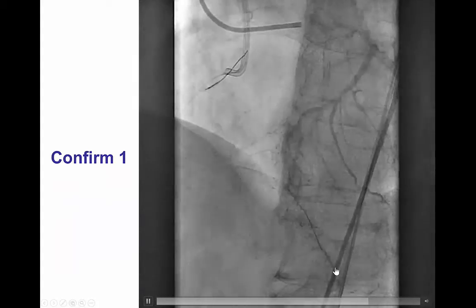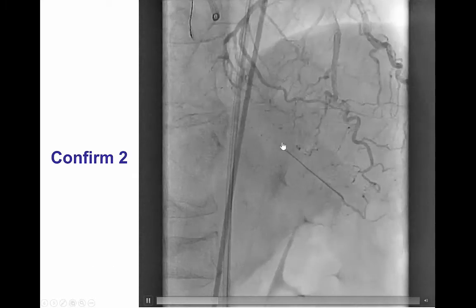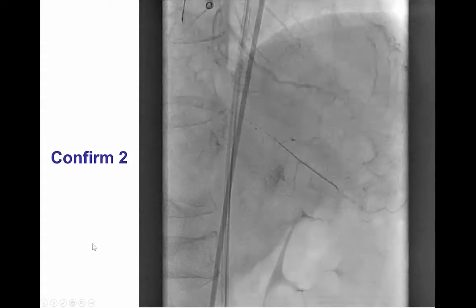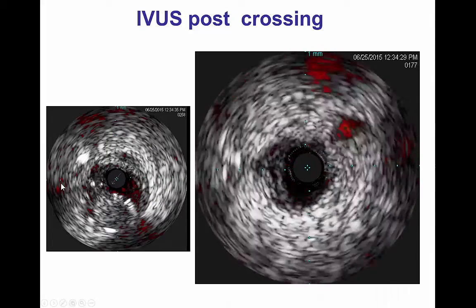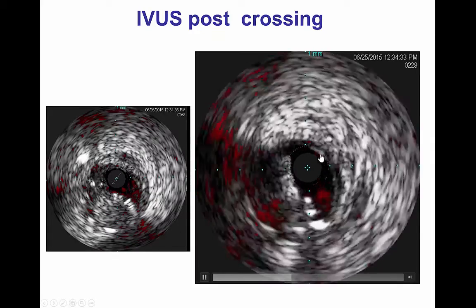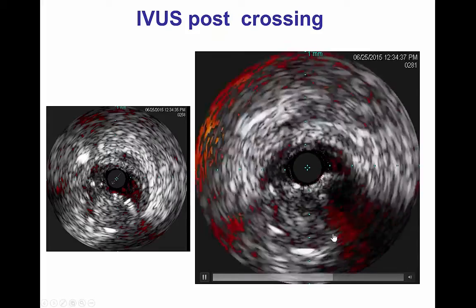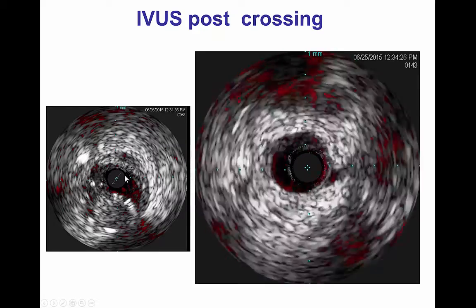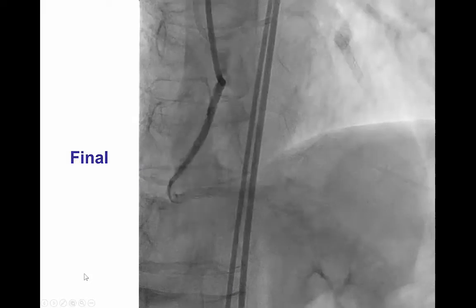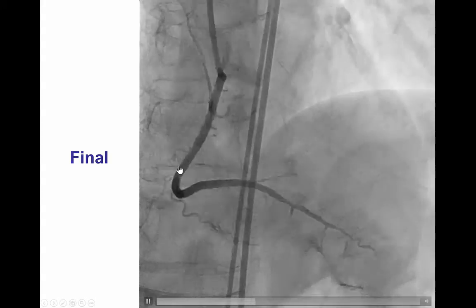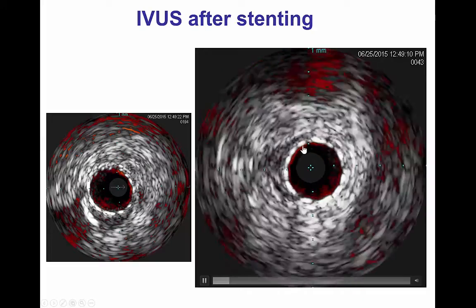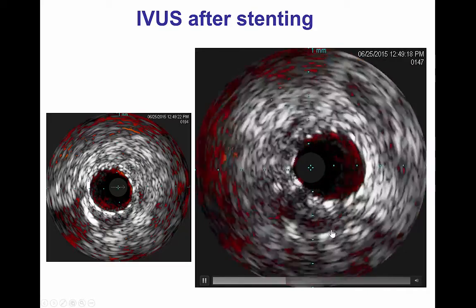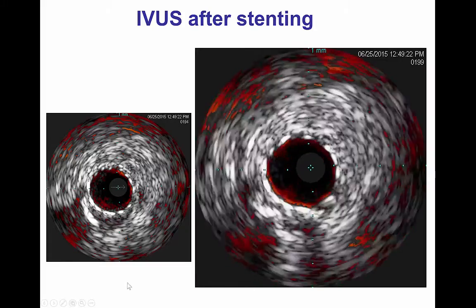By doing this, we now have the wire into the PDA in good position. We confirm in an orthogonal view and indeed have distal true lumen access, wiring proximal to the proximal marker of the Stingray balloon catheter. We were able to advance and perform pre-dilatation with a small balloon, and we can see sub-intimal crossing into the distal vessel as well as crossing around the previously placed stent. This fascinating finding shows we are still within the vessel architecture but in the sub-intimal space around the previously placed stent. We were finally able to place several stents and recanalize the lesion, and final intravascular ultrasound demonstrated nice stent expansion and stent apposition, with compression of the previously placed stent crushed into the sub-intimal space.